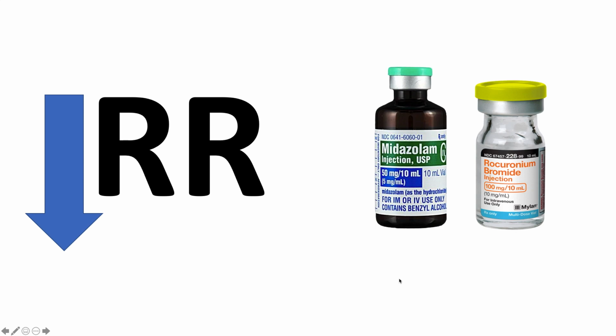So we start at an 8 to 12 respiratory rate, and what that does is allow time for expiration before the next breath is initiated. And sometimes you have to even go lower than that, but also making sure that your patients are properly sedated, and sometimes even paralyzing them. If you have a bad asthmatic who's breathing 20 to 26 times on the vent and air trapping, you're probably going to have to paralyze them and sedate them so that you can take over and breathe them around 8 to 10 breaths a minute.